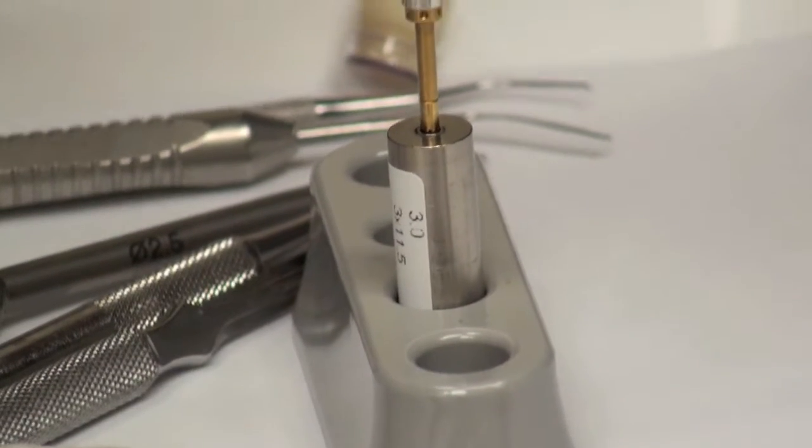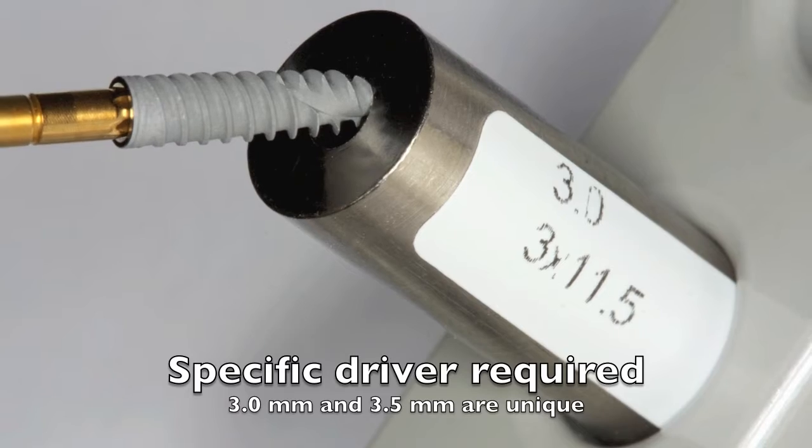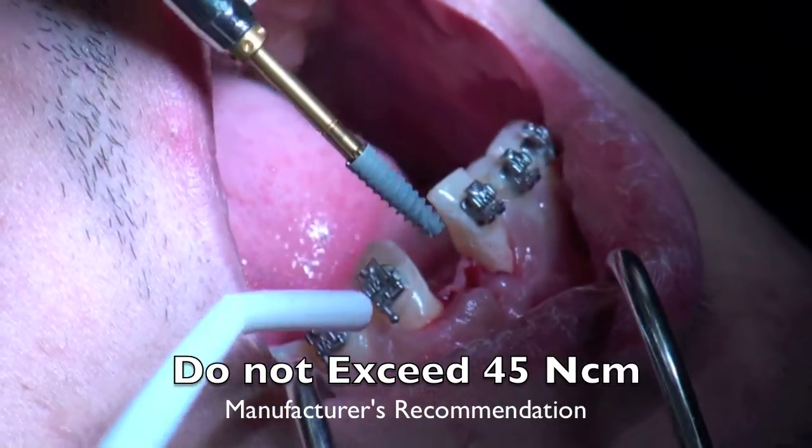Here's the exciting part — here's the 3.0 millimeter implant. It's a little tiny implant, nice and slender, but with a very generous thread, which enables us to get a nice torque value of 45 newtons, which is recommended by the manufacturer.